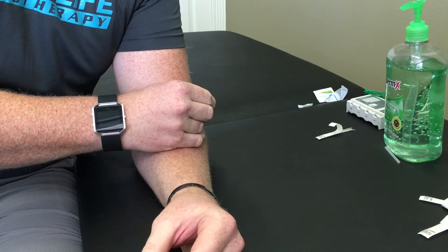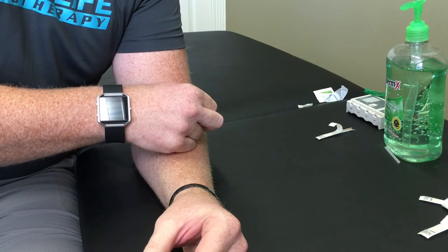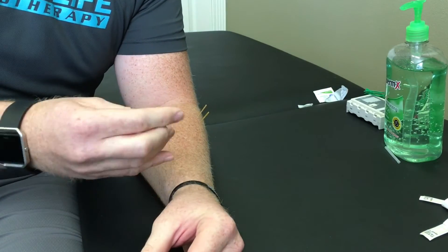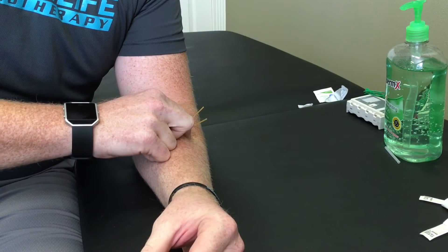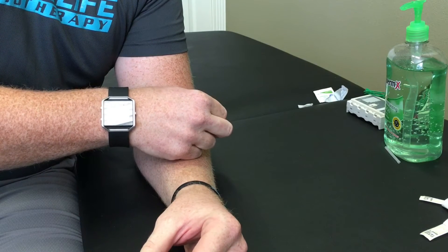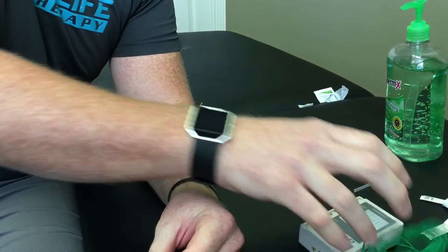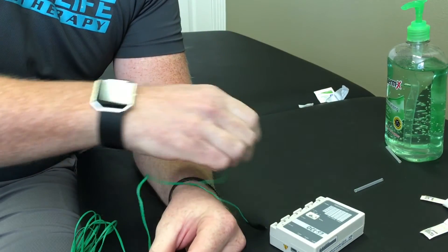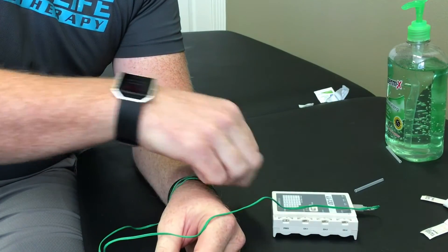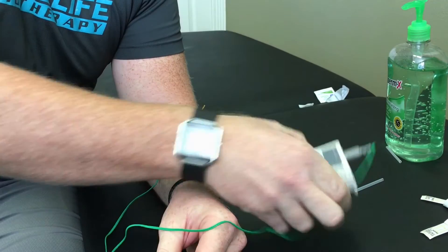I'll probably do a couple more needles. A little twist. I'll just get one more. Not too bad, and I'm also going to hook up some electrical stimulation, which enhances the effects of the needling. Just clip that on and turn that up.